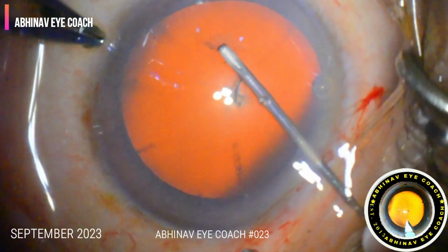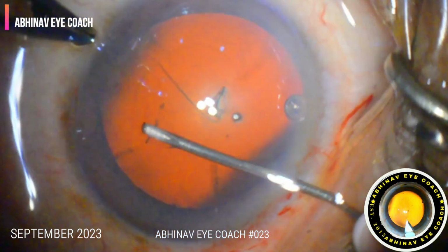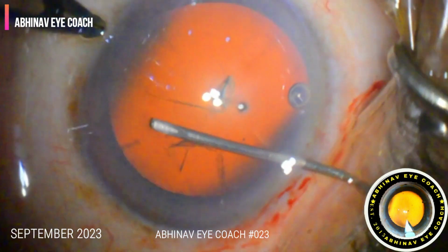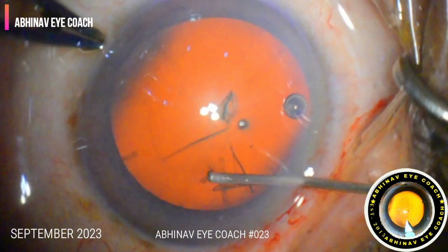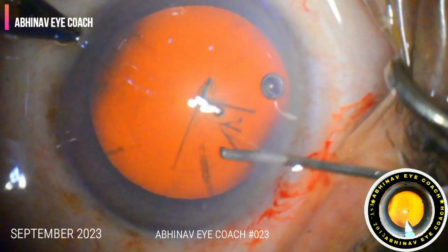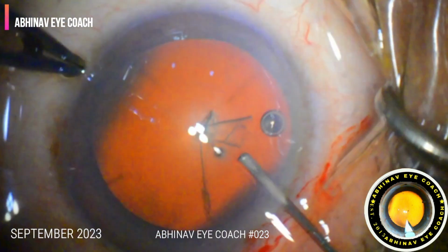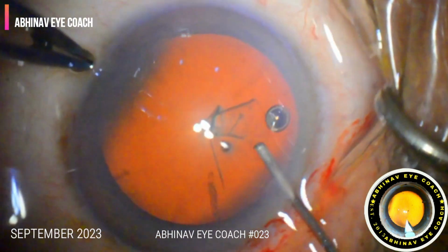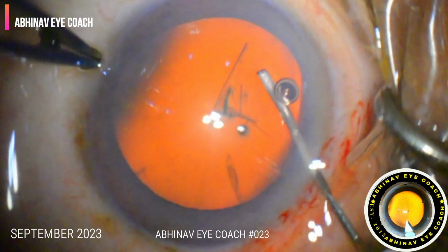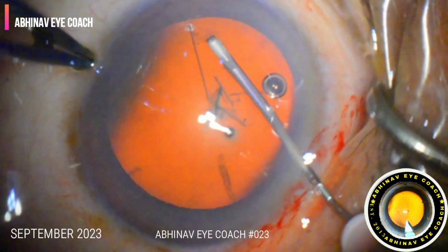I like to perform the capsulorhexis with the capsulotome needle only. So a perfect, adequate size 5.5 millimeter rhexis is performed as the optic of the lens is 6 millimeter. So a perfect round rhexis is made first.